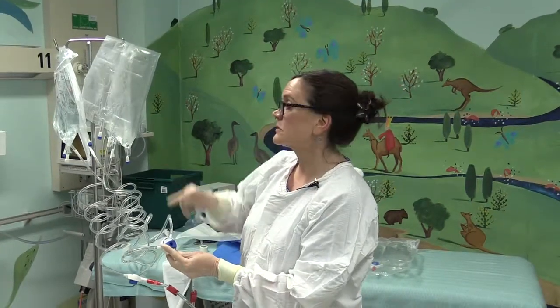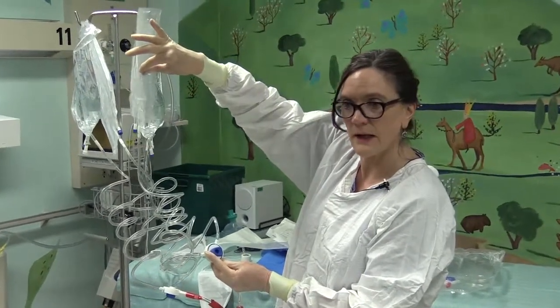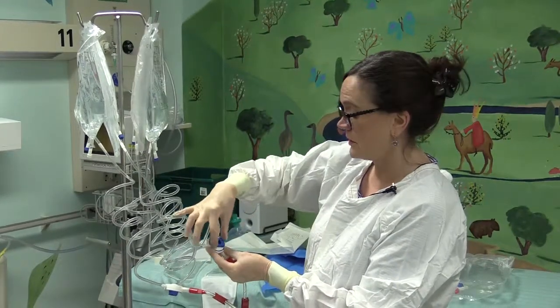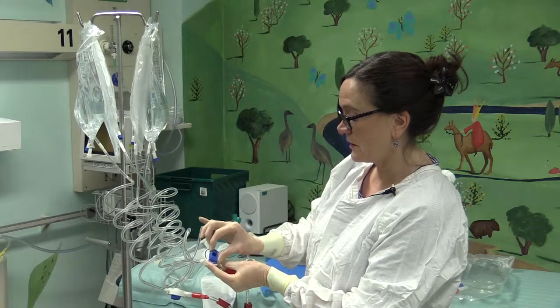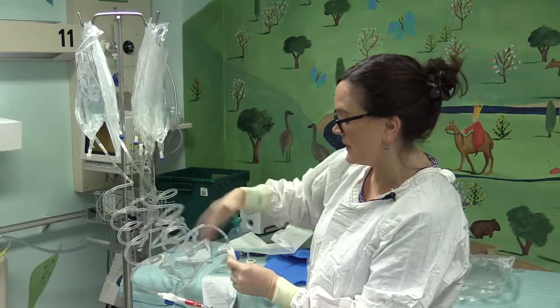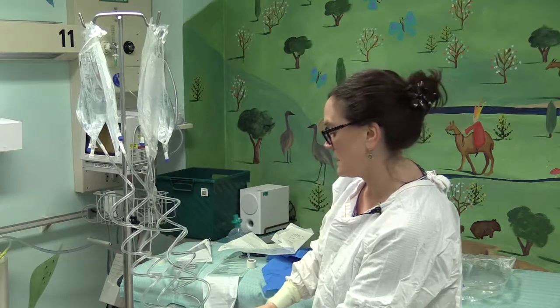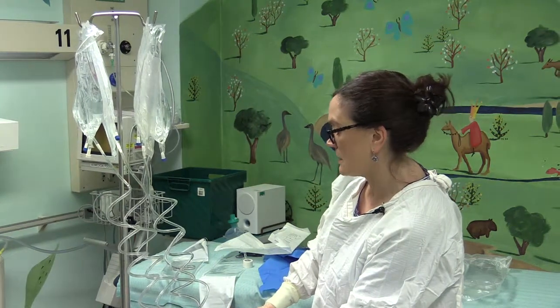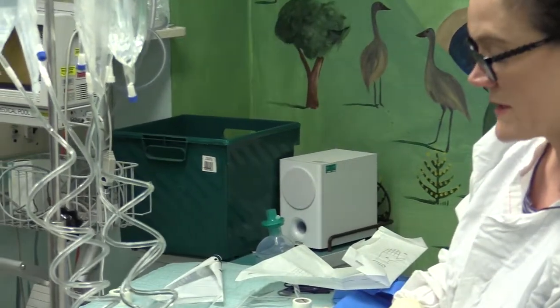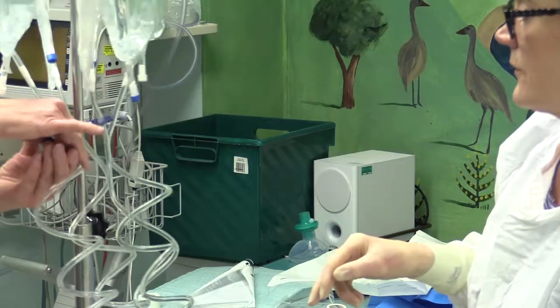So to run the air from this bag into that drain, empty bag, I'm going to turn the dial to number 2. Just tapping the air out so that there's no possibility of running air accidentally into the patient. Once all the little bubbles can no longer be seen, my assistant will put a clamp on.